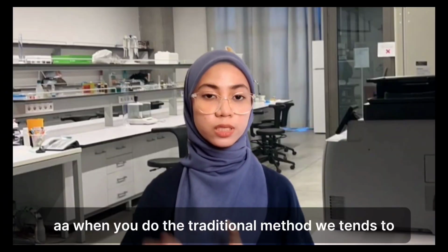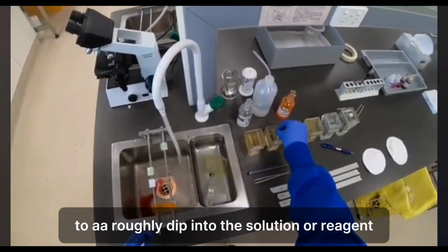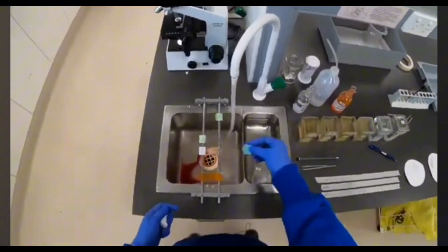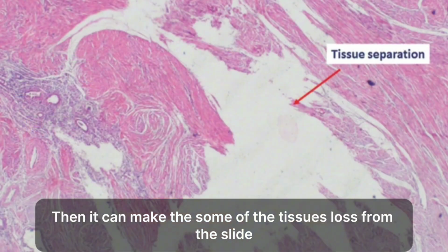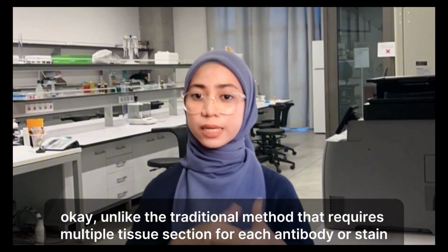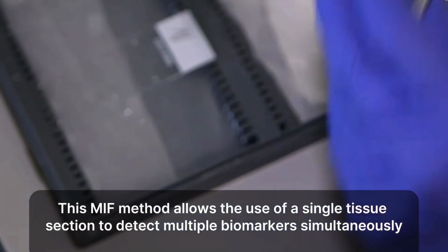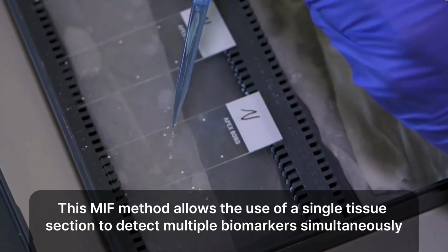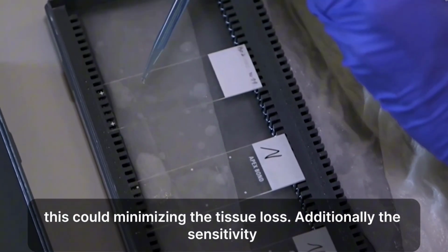Sometimes when you do a traditional method, we tend to roughly dip into the solutions or reagents, and then it can make some of the tissue lost from the slide. Okay, unlike the traditional methods that require multiple tissue sections for each antibody or stain, this MIF method allows the use of a single tissue section to detect multiple biomarkers simultaneously. This could minimize the tissue loss.